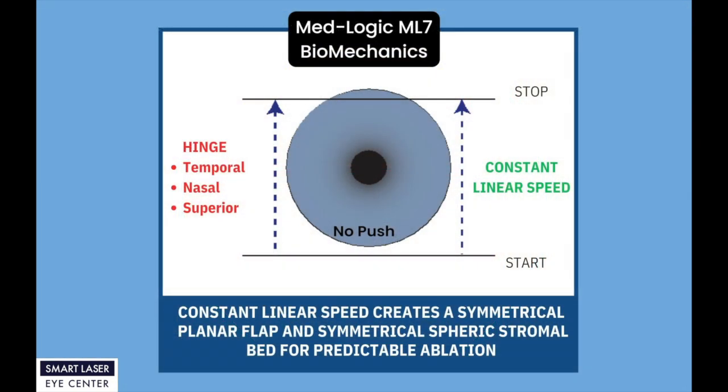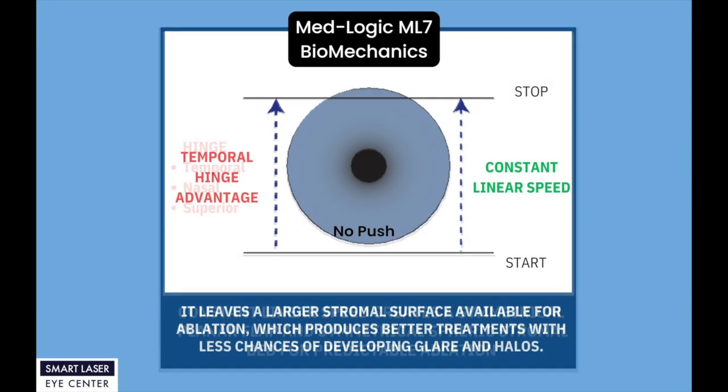ML7 can create temporal, nasal, and superior flap easily. Constant linear speed creates a symmetrical planar flap and symmetrical spherical stromal bed for predictable ablation. Temporal hinge flap creation leaves a larger stromal surface available for ablation, which produces better treatments with less chance of developing glare and halos.